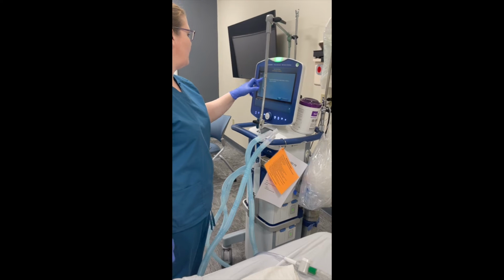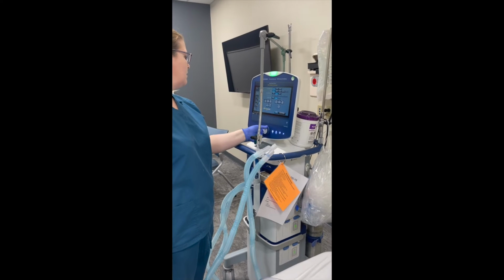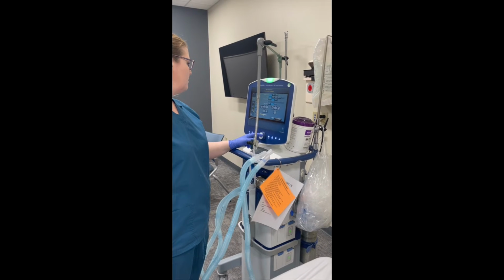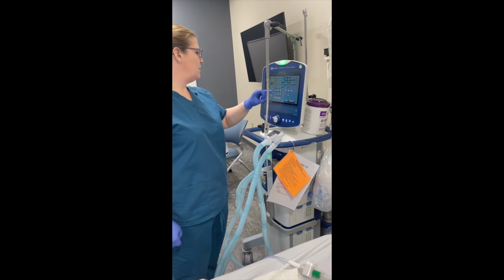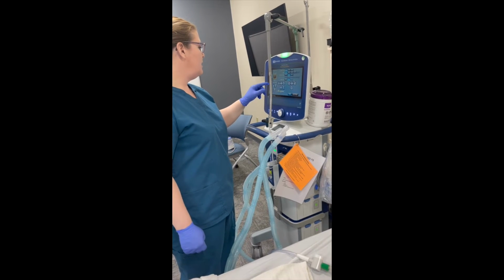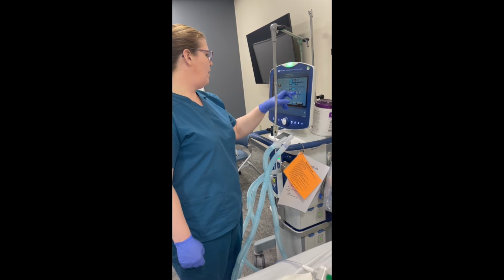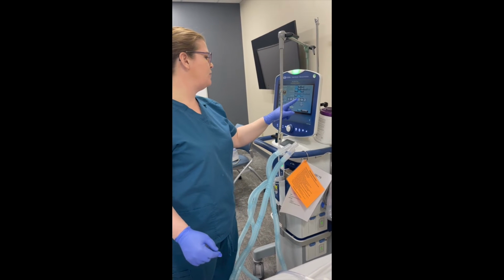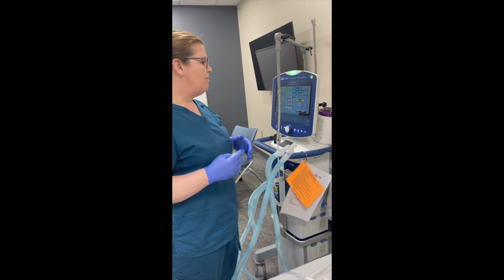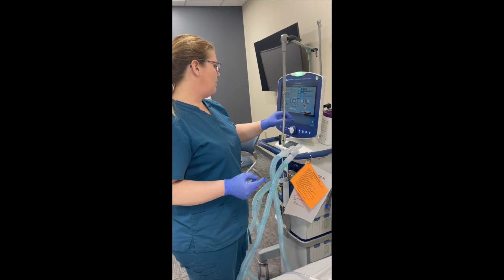We're gonna set up the ventilator for an 80 kilogram male. Okay, let's see. Actually, I'm gonna skip over my frequency. I'm gonna check AC, VC is our mode, and sensitivity is at 3, so I'll keep it there. We're supposed to run this at 100% FiO2, but to conserve oxygen, I'm gonna crank it down to 21% FiO2, but if this were a real code scenario, I would want this patient on 100% oxygen. So I want PEEP of 5.